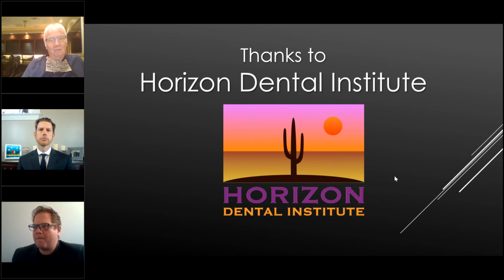I wouldn't worry about the field of view. There is no ideal one. I would select a machine like out of the Vatech family that allows you to pick a different size field of view depending on your task. So for something like implant planning, you might think I only need a small field of view. But last week I was reminding people that if the patient has a problem on their condyle, a little spur, some osteoarthritic change, you change their bite on the opposite side, they might come back to you in 2 weeks and say, Doc, I can chew great, but how'd you make my joint hurt? Okay, so you really are treating the patient. You're not just providing one sort of task that they ask for, their implant or the root canal.